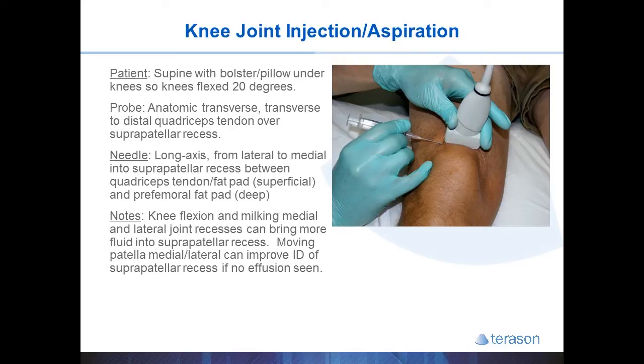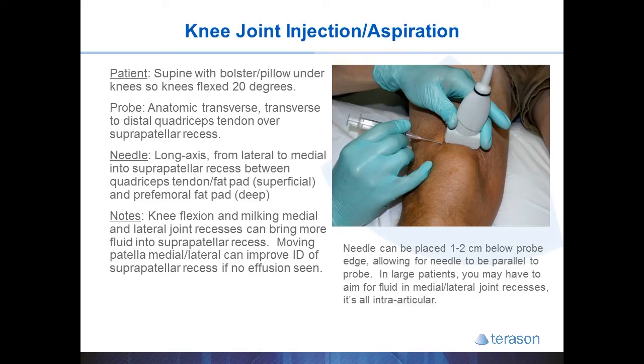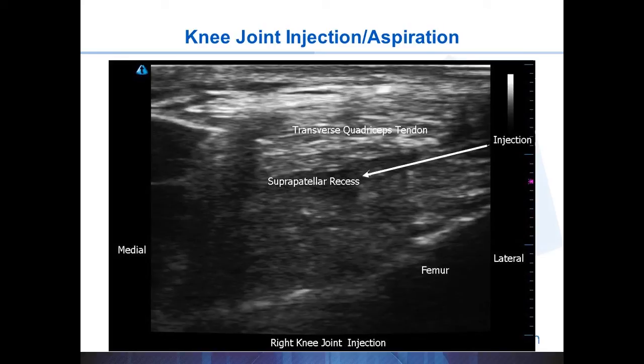In this example you can see the needle is almost completely parallel with the probe, achieved by not entering exactly next to the probe but actually one or two centimeters below it. This allows you to keep the needle very parallel to the probe. The needle enters nicely below the quadriceps tendon to access the suprapatellar recess. In very large patients you can milk fluid from other compartments into the capsule, or a large effusion can sometimes be easier to access in the lateral joint recess — during your pre-procedure scan simply look for fluid and inject or aspirate from wherever is easiest.